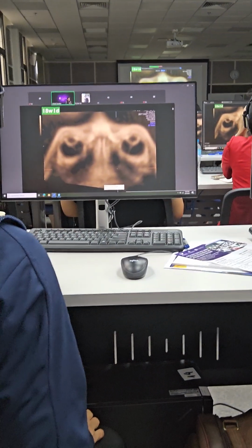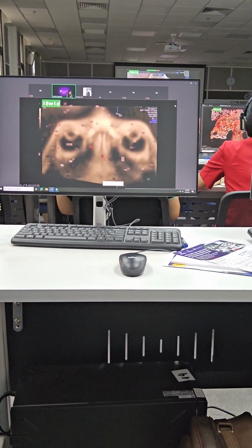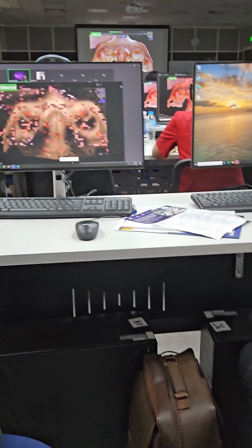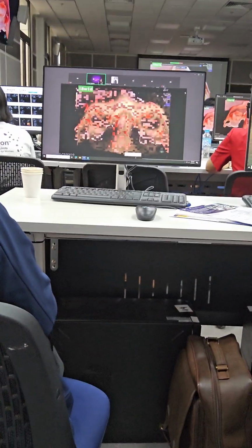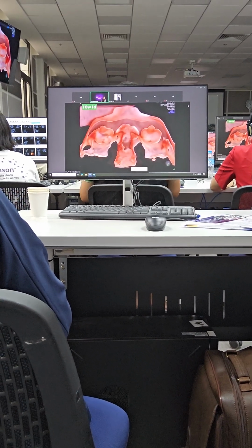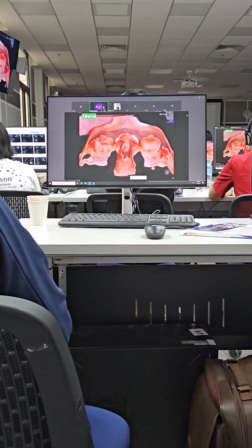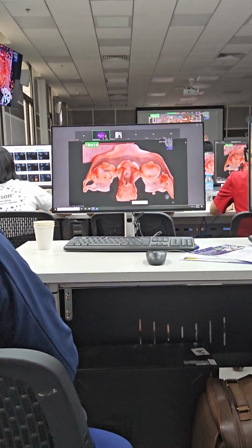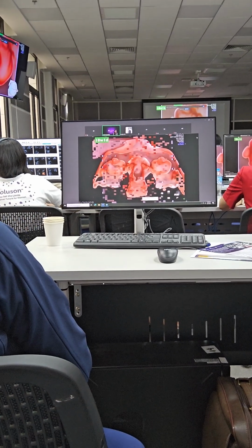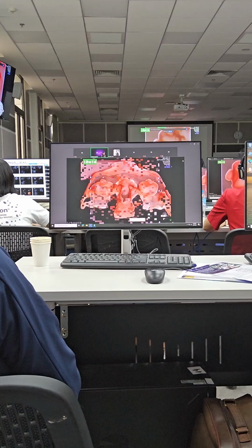And if we use the silhouette ultrasound, here you can see the bilateral eyeballs with lens, and then from the side, lateral view of the vitreous body is like this. Okay, so this is the vitreous body, and this is a lens, and this is by the ultrasound.